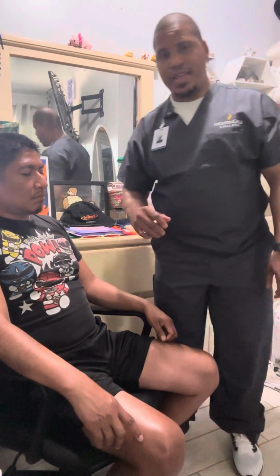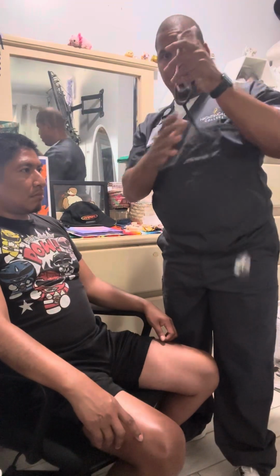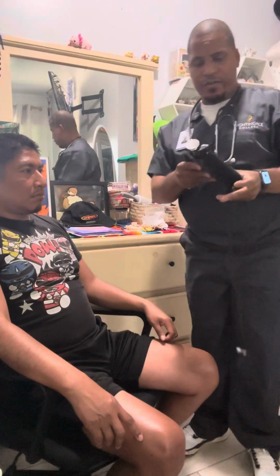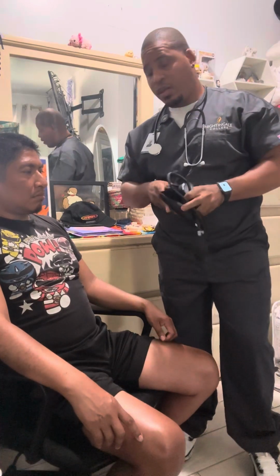Next, I will be taking his blood pressure. So when taking his blood pressure, I will be using my stethoscope, blood pressure cuff, normal size, sphygmomanometer.